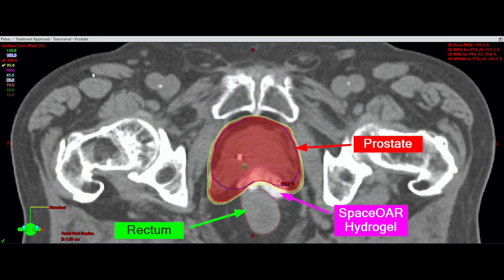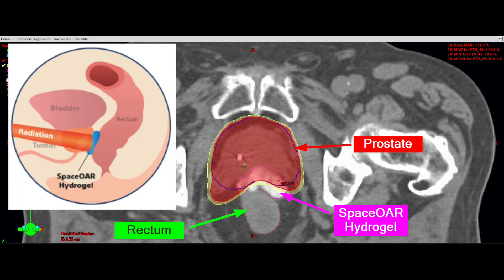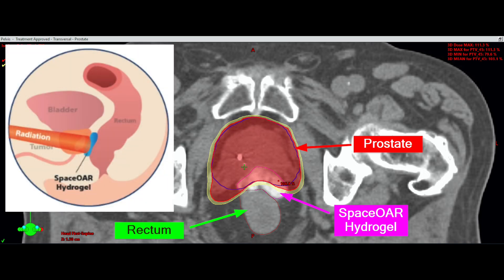What you have in front of you right now is one slice of the three-dimensional treatment plan that we use to look at the radiation. We're looking at radiation covering the prostate. You can see the hydrogel in between the prostate and the rectum, and then the rectum on the other side of the hydrogel. If you imagine the hydrogel is not there, you can see where this color of radiation would be touching the rectum. But with the hydrogel, that color of radiation is only hitting the gel and not the rectum.